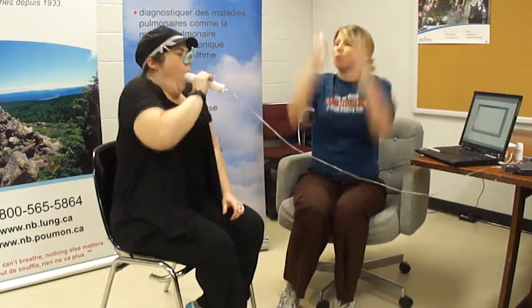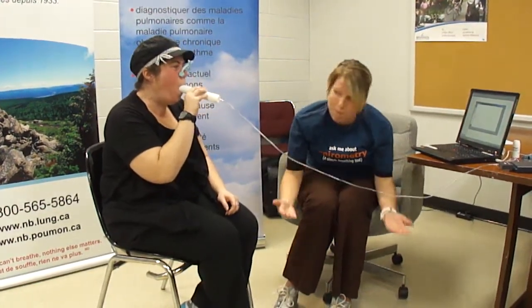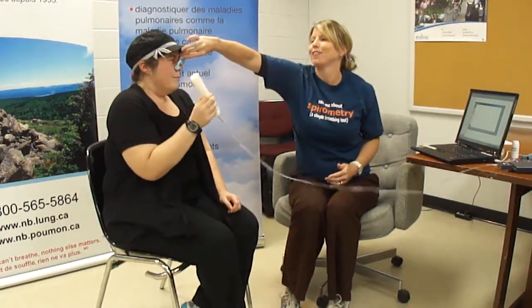I'm thinking I took my poppers this morning. Okay, we're all set. Put that in your mouth. Great big breath in. And throw it out hard. Push, push, push, push, push, push. Three, two, one. Big breath back in. Take it out — you got your face nice and red. You're doing wonderful.